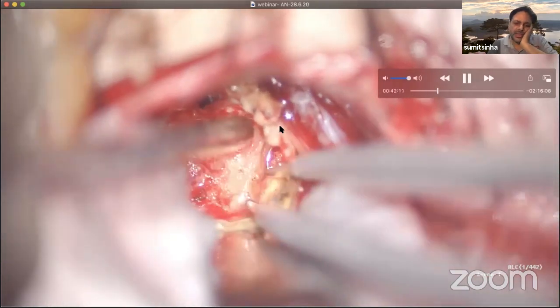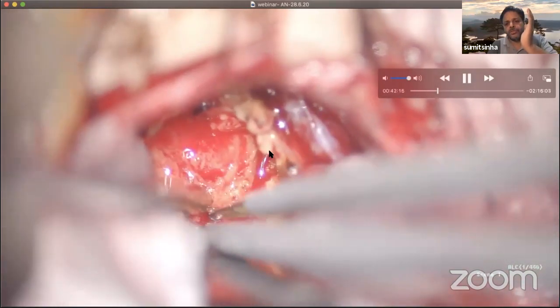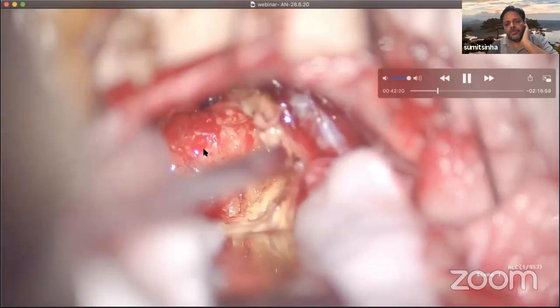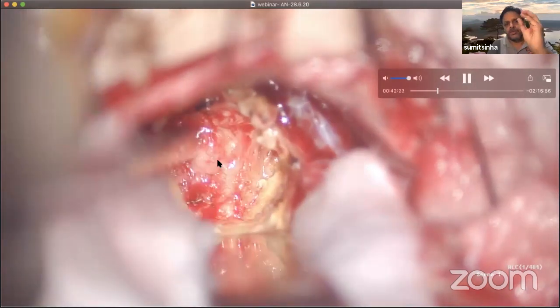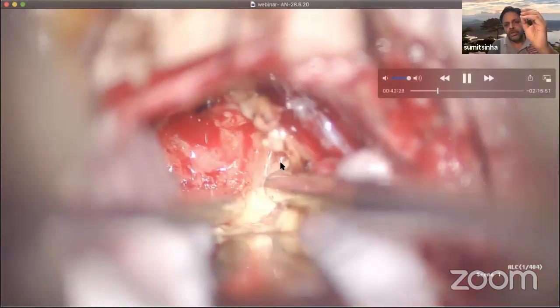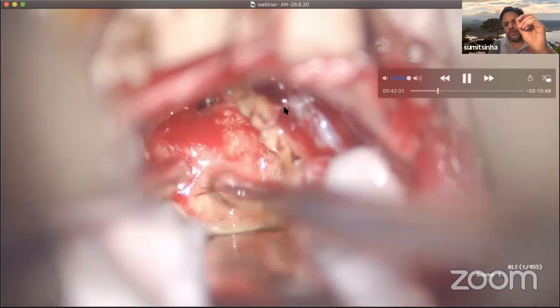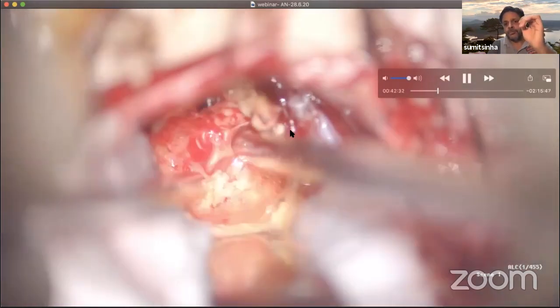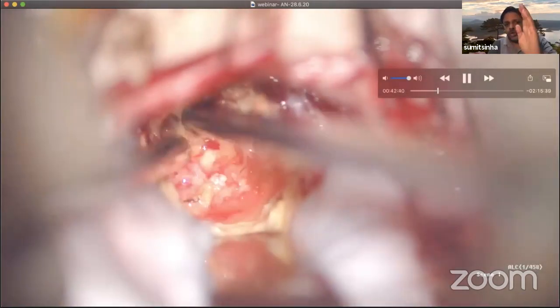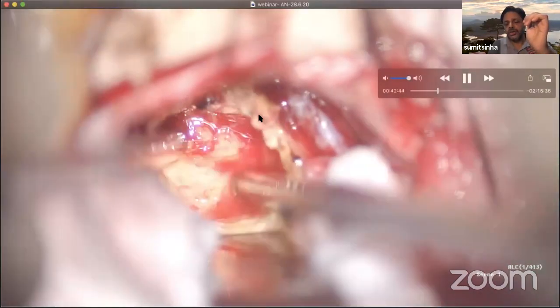The reason is that you have to move in order of preference because you want to save the structures in order of their priority. If you decore from the center first, then the capsule becomes more manageable. And then if you go down to decore the lower part, you first get to separate the lower cranial nerves, which are very, very important. And most of the time you get to find the facial nerve here also. So the facial nerve and the lower cranial nerves are lying somewhere near the lower pole.